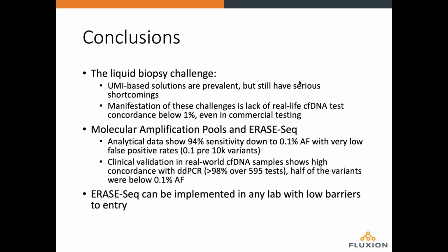So finally, what I want you to walk away with is that despite the prevalence and the good analytical success of UMI solutions, there are significant shortcomings when trying to apply those solutions to cell-free DNA and other liquid biopsy samples where we have limited sample input and very low allele frequencies. And even in commercial testing, for tests that are really well developed, there's still a ways to go to achieve good concordance between those tests, sub 1%.